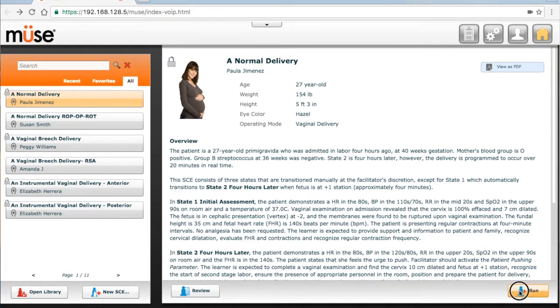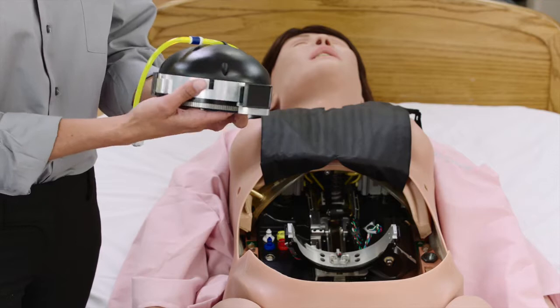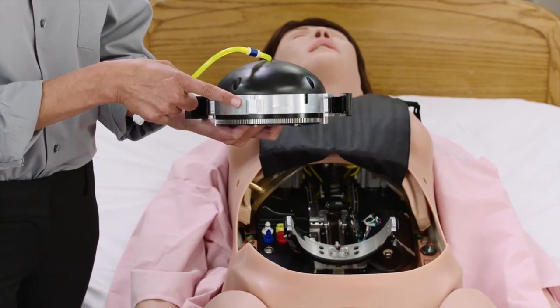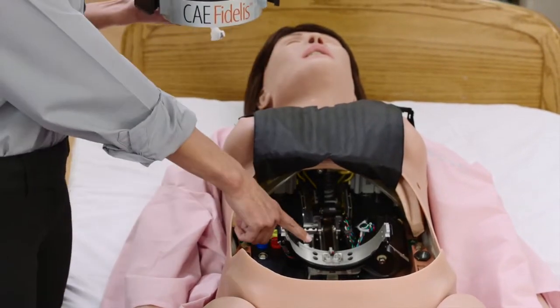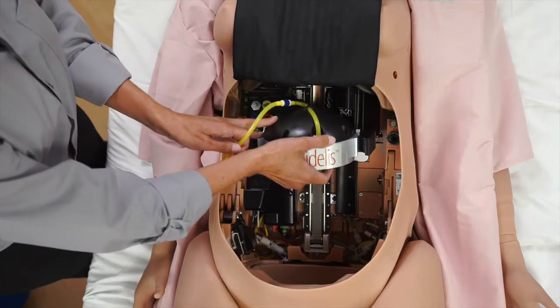A setup instruction screen will be seen. The rotation ring must be installed prior to running a delivery SCE. To install the rotation ring inside the mannequin's torso, align the rotation ring tab, which is located on the side opposite of the CAE Fidelis logo, with the rotation ring groove inside the mannequin's torso. Secure the clips on each side of the rotation ring.